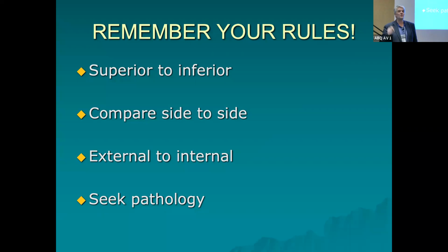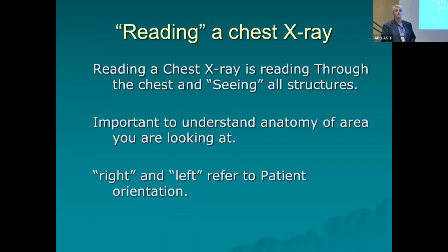If you assume normal, you will not question anything. If you assume pathology, you are more likely to investigate, dig, and determine, could that little bitty patch that I see be the problem? Versus if you assume it's normal, you dismiss it, okay? So my pearl for you today is always seek and assume pathology. Assume something's wrong until you can absolutely rule out that there's nothing there, then you're safe and you've interpreted.